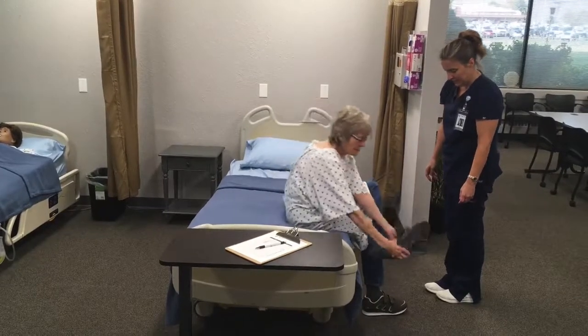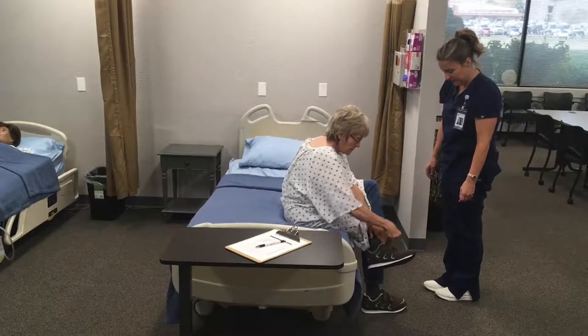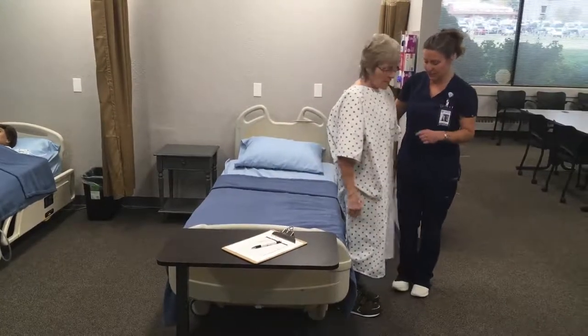Thank you. And then I'll help you stand up. And then we'll walk over to the scale.